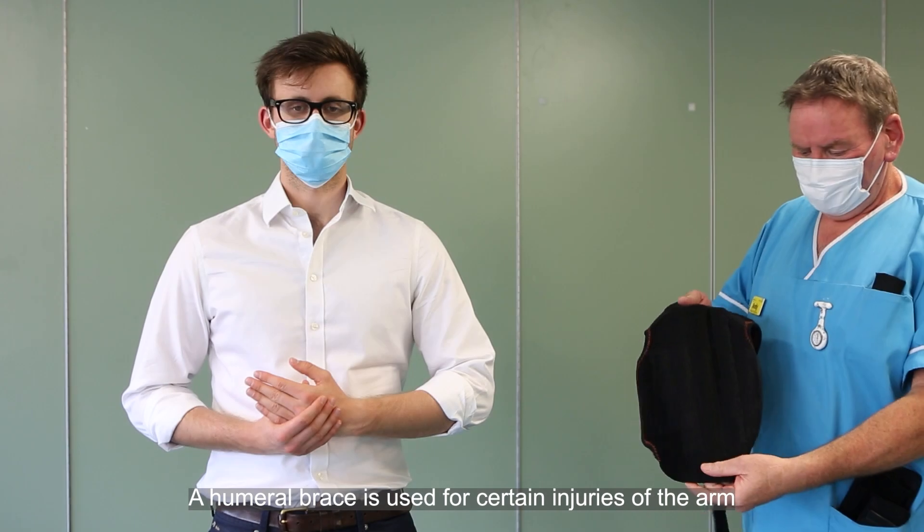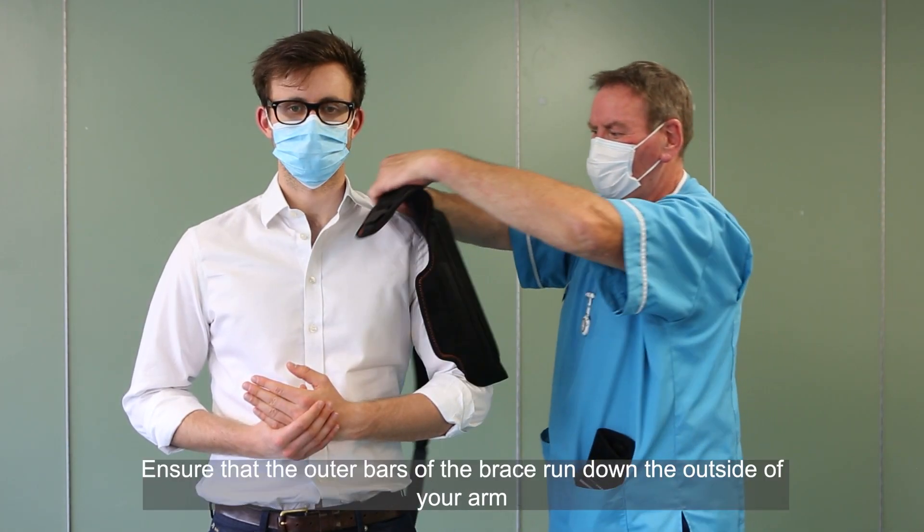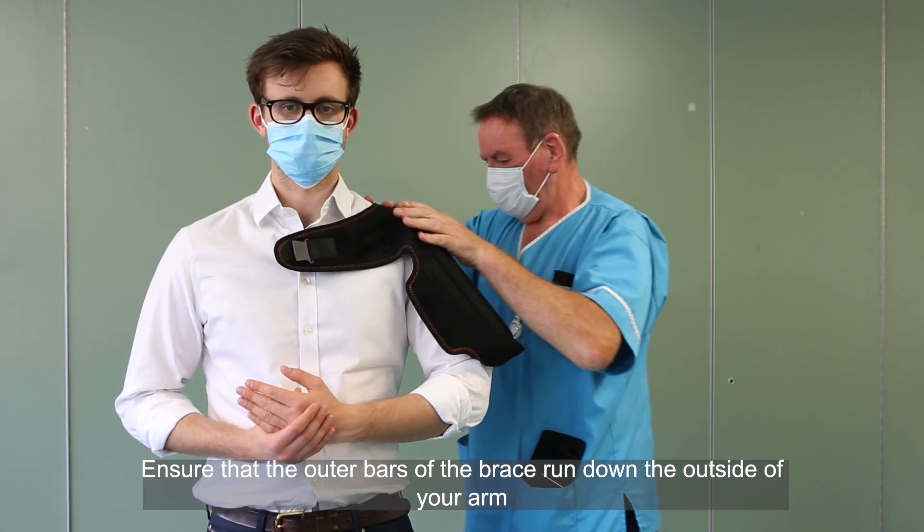Humeral brace. A humeral brace is used for certain injuries of the arm. Ensure the outer bars of the brace run down the outside of your arm.